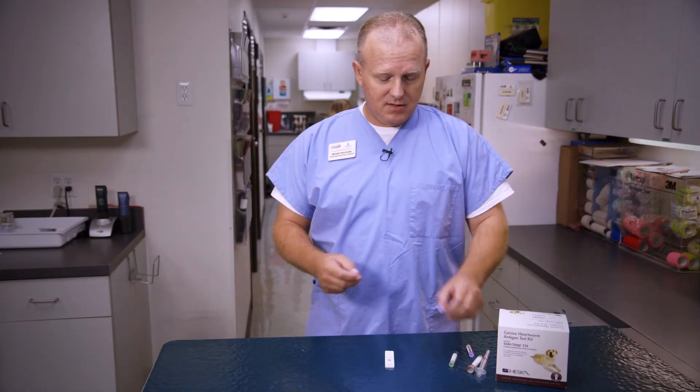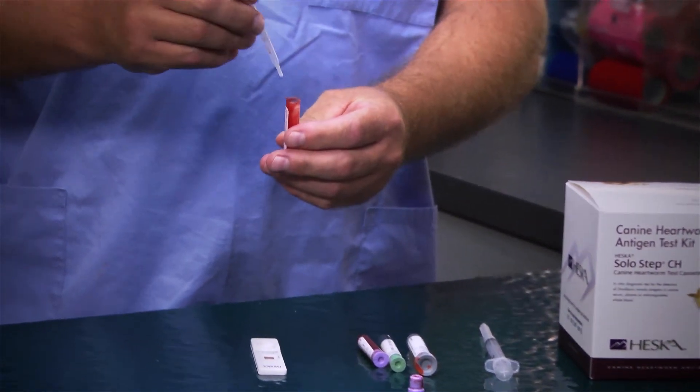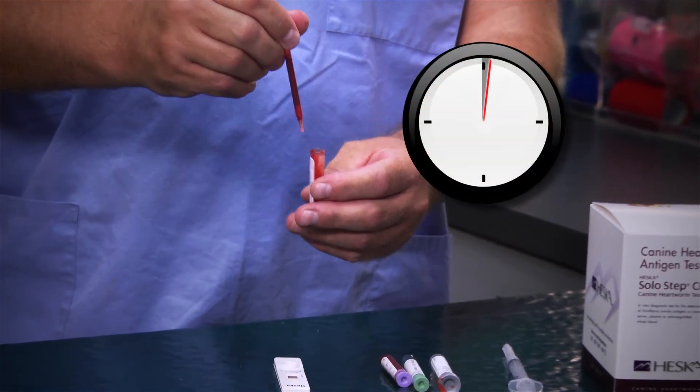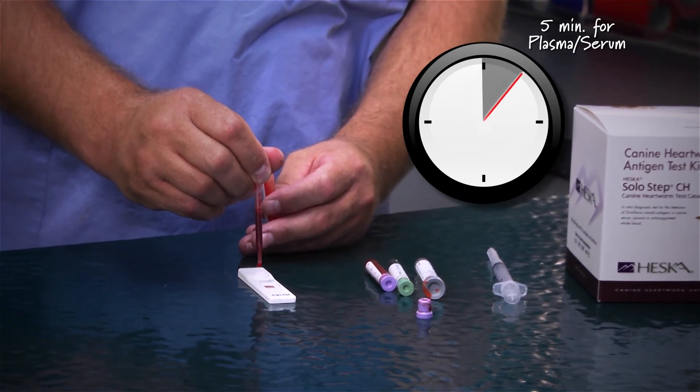When you do your test, you're going to be using just three hanging drops of blood. It comes with a little dropper — get your sample and then just three drops of blood into your test.